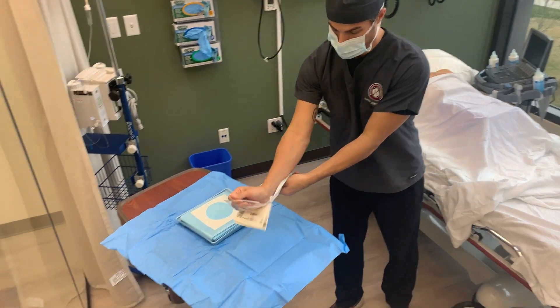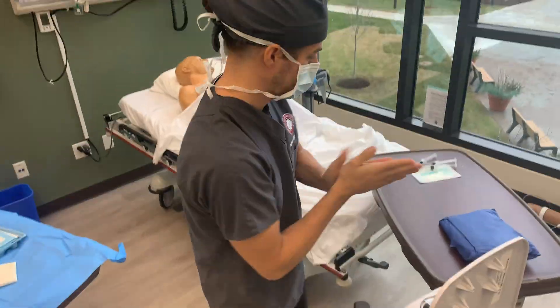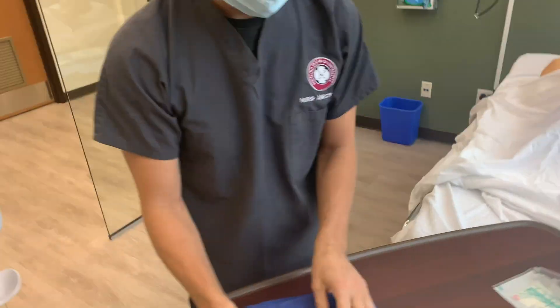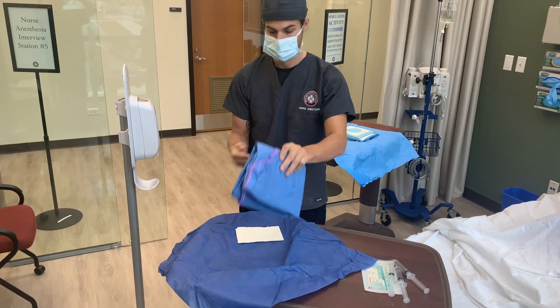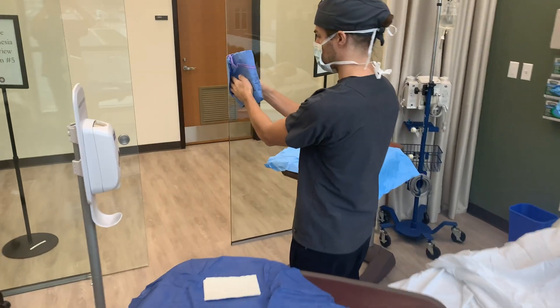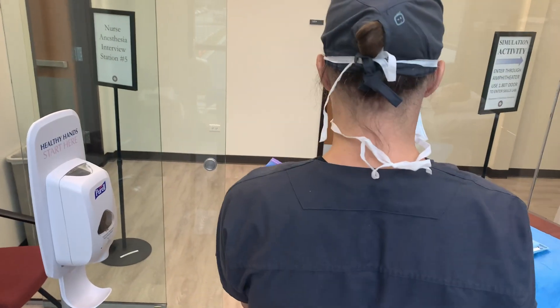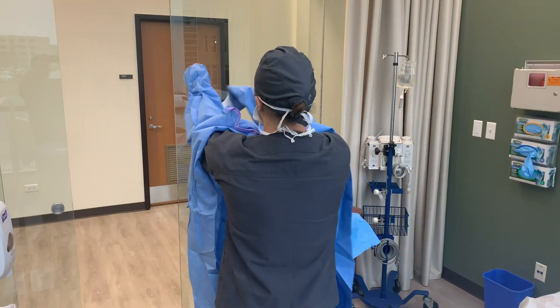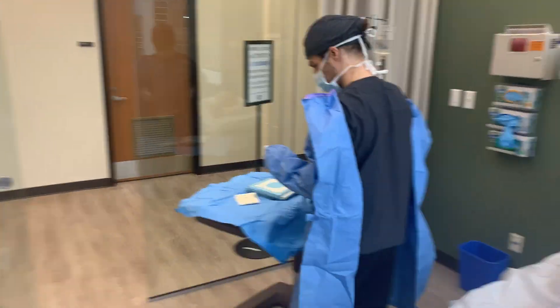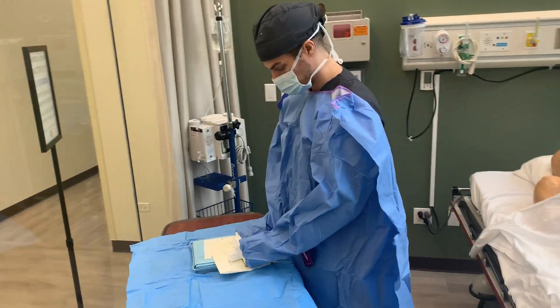Open and don your sterile gown and gloves. When placing a sterile gown, carefully grab the center of the gown near the neck. Place your hands inside of the sleeves and extend your hands toward the white sleeve cuffs, being sure not to expose your fingertips. As the gown opens, beware that it does not come into contact with your surroundings.